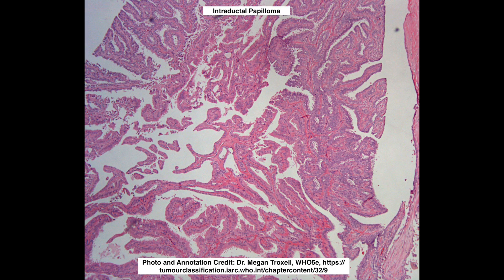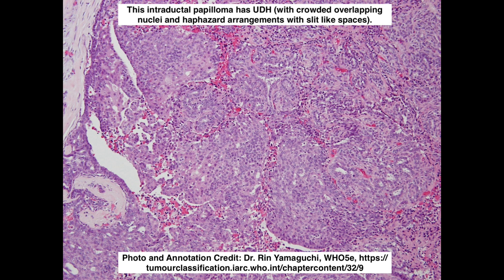Here's another instance of an intraductal papilloma. If we did a P63, the myoepithelial cells would highlight within the lesion as well as surrounding the periphery. Intraductal papillomas can also have proliferative fibrocystic change, like usual ductal hyperplasia, where you can see haphazard arrangement of the nuclei with some overlapping and some slit-like spaces.